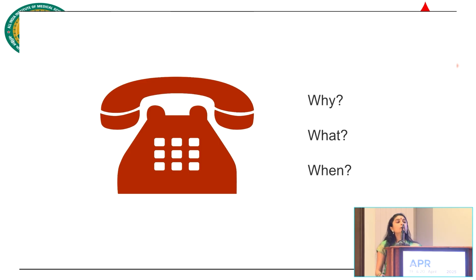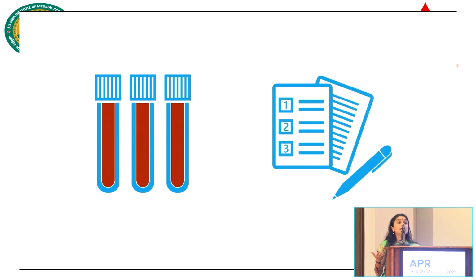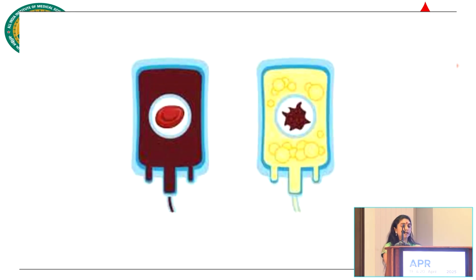After that, collect from the other hand one sample in EDTA, one sample in plain, a urine sample, and send the blood bag with the transfusion set in situ to the respective blood bank or blood storage unit where you received the blood bag.